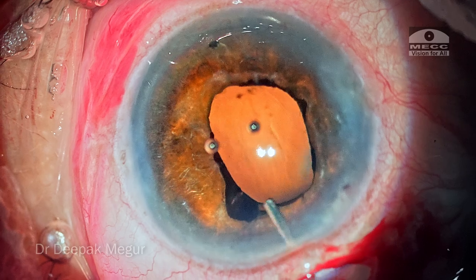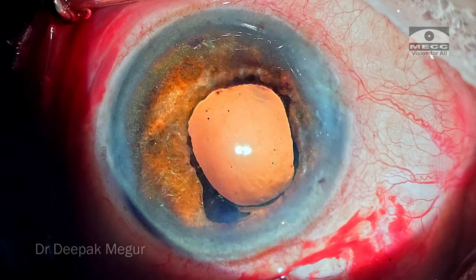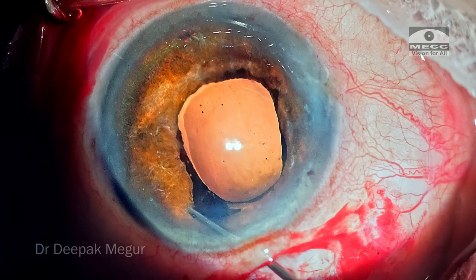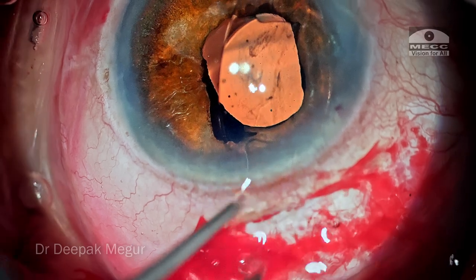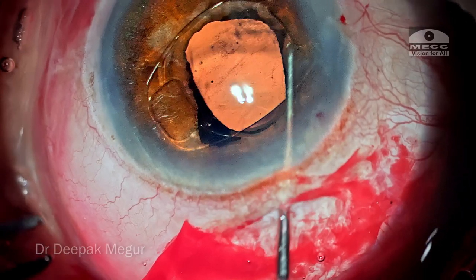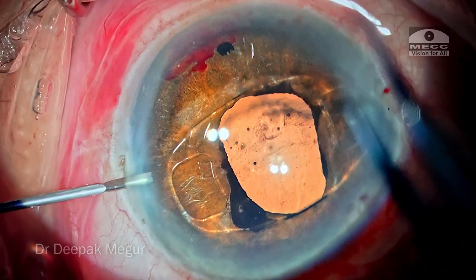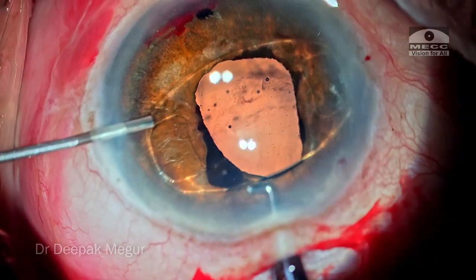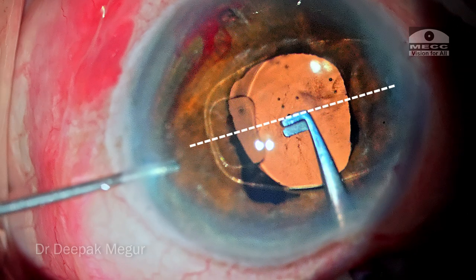Time to implant the iris clip lens. I'm using just a little bit of pilocarpine to bring down the pupil, but because the sphincter is atrophic and the pupil was fixed at this position for quite some time, it's not coming down. The lens is gently introduced into the eye under the cover of OVD. The lens is gently maneuvered so that both haptics are at the 3 and 9 o'clock position and the notches are near the vicinity of the side port incisions. I'm using a 26G cannula introduced first, followed by the forceps to grasp the lens, with the notches of the forceps exactly at the level of the notch to help identify where to press on the iris.